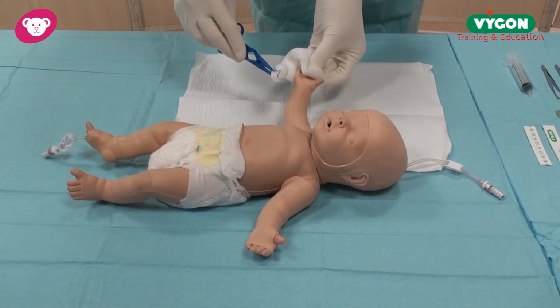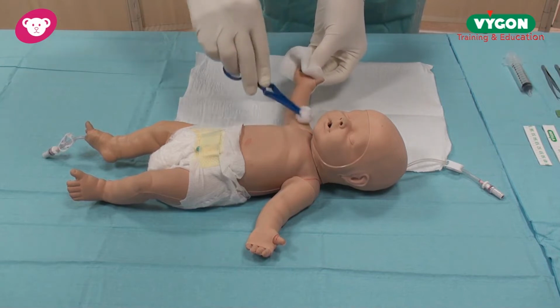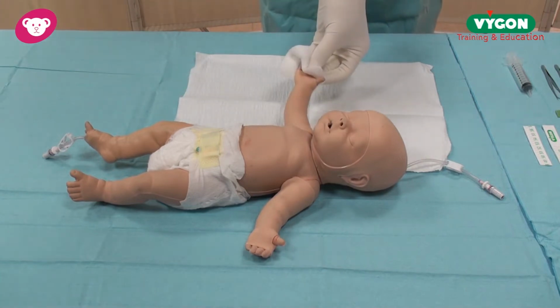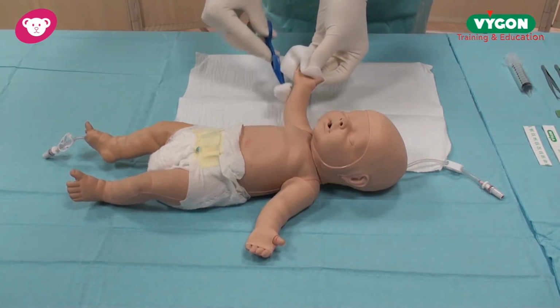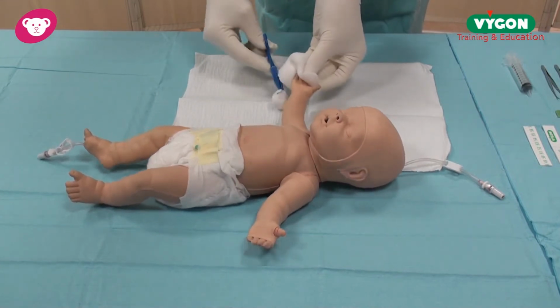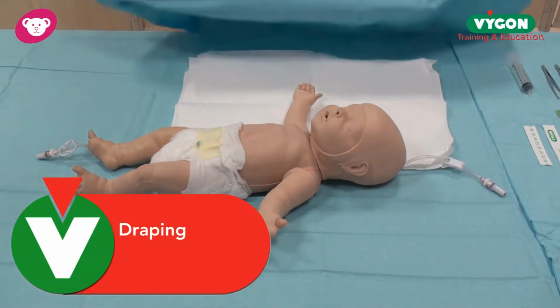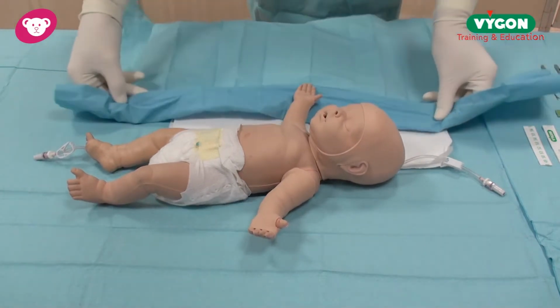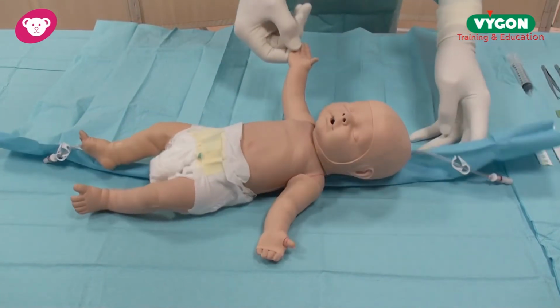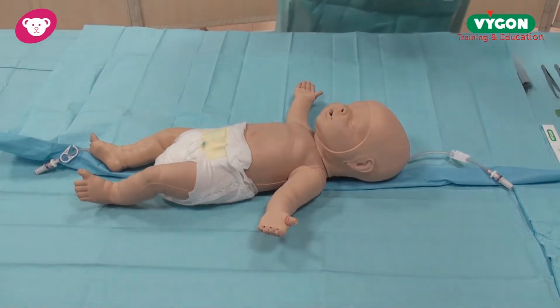Before I place the drapes, I'm now just going to wash off the povidone iodine or the chlorhexidine with sterile saline. This will make sure that the baby's skin is not irritated. Now I'm going to place the first drape under the baby's arm, like so. This then protects the area where I'm going to place the PICC catheter.